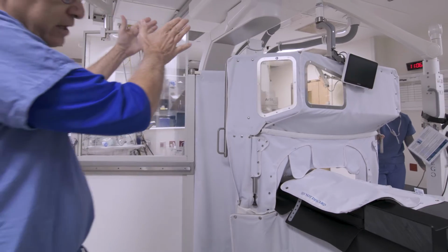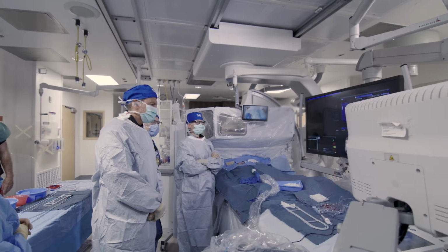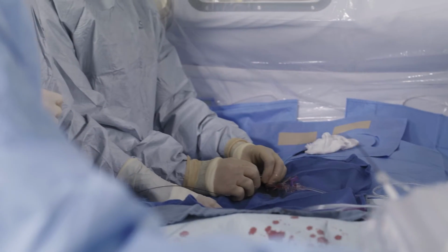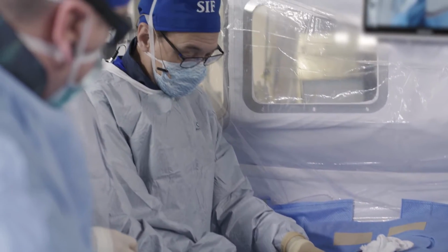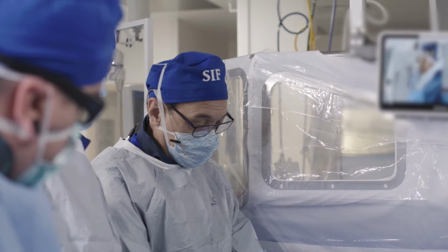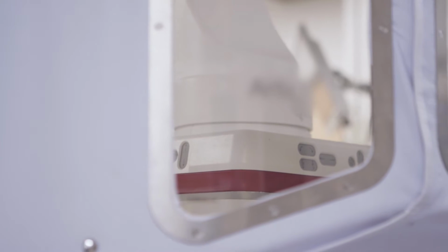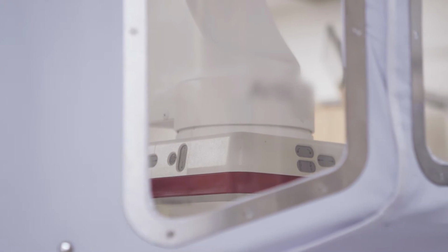We have done research in our cardiac catheterization laboratory on one such system. And based on the data we have, you could perform 1,000 procedures a year. Now, that's a lot of procedures. You could perform 1,000 procedures a year and still only be at 2% of the maximum allowable threshold for radiation exposure in a year. Some of these new systems are very slick, and they really do reduce the radiation exposure to zero or near zero.